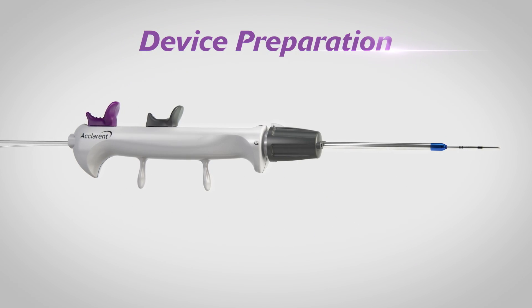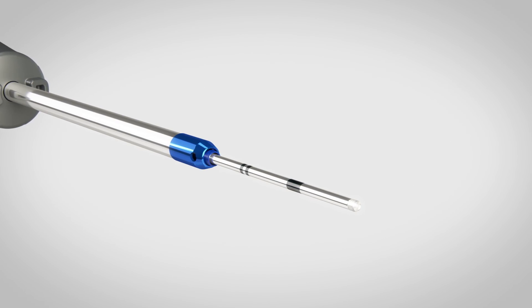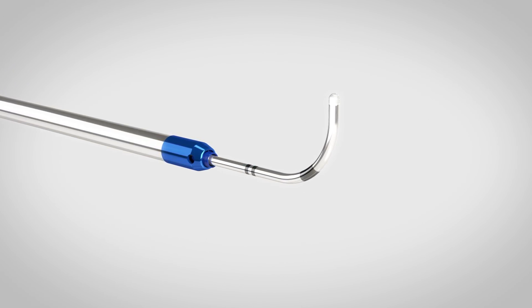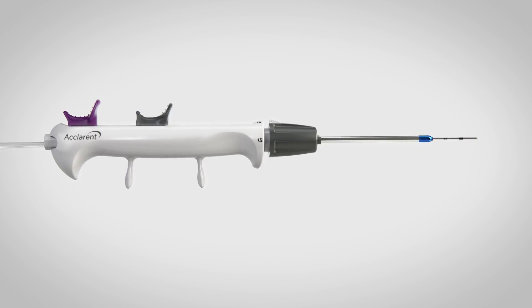Device preparation for right-handed surgeons: The device must be prepared to access sinuses in the following order — sphenoid, frontal, maxillary. Once the rail tip is shaped, it cannot be straightened. The device is packaged ready for use in the sphenoid sinus.